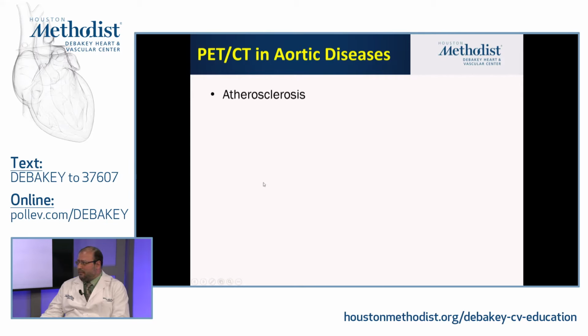Can you give us a clinical scenario when you would want to image atherosclerosis using PET? So for atherosclerosis, most of these are still at the level of investigation. But for example, for carotid disease, this is a common scenario. If you have a patient who's coming with stroke and you have two lesions bilaterally and you're doubting which one would be potentially the culprit, if clinically both of them can be applicable, or if you want to give preference to one versus the other.